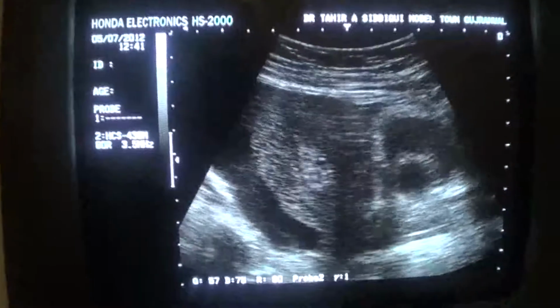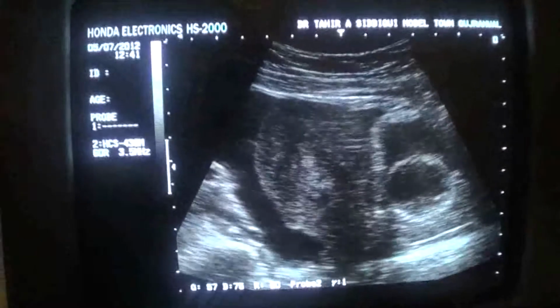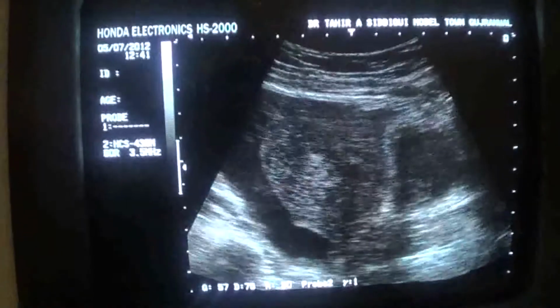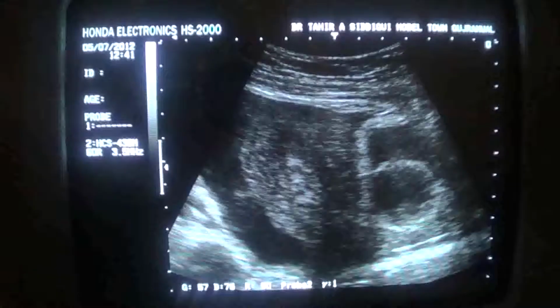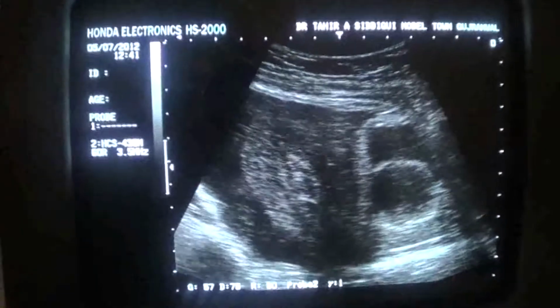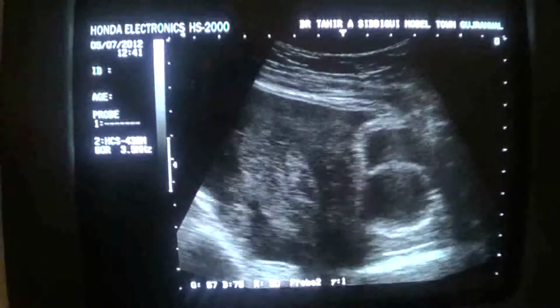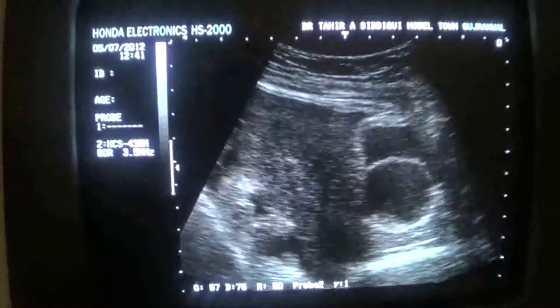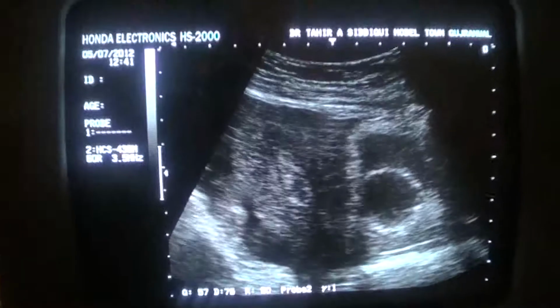Here you are seeing a female pelvis. History of amenorrhea of 2 months, had D&C a few days back. Now is having vaginal bleeding with severe excruciating pain, vomiting, low blood pressure, high pulse. Now what we are seeing is the uterus in longitudinal section.